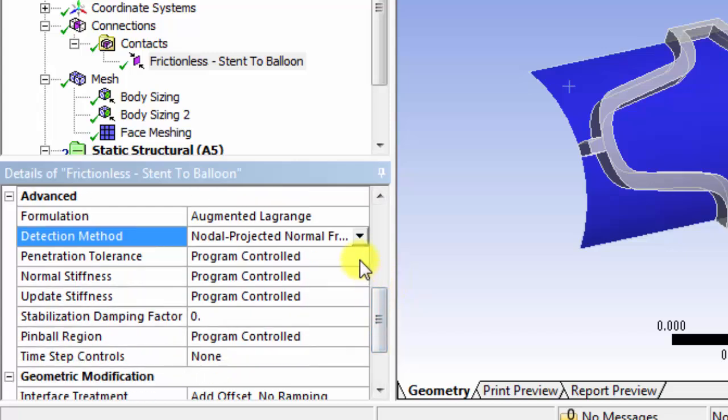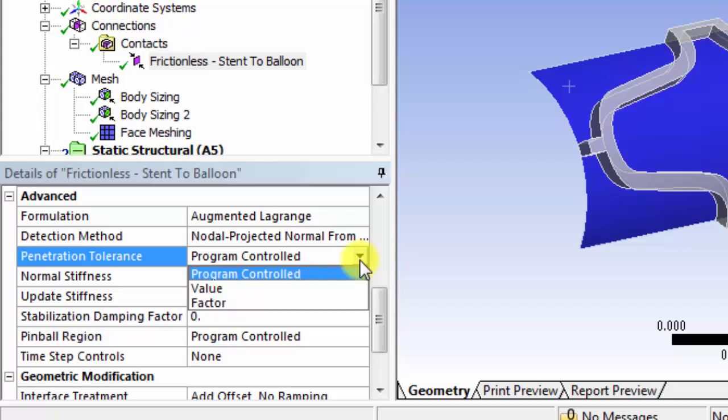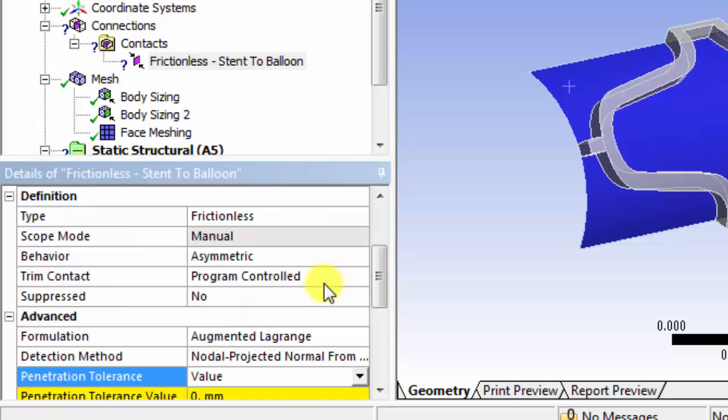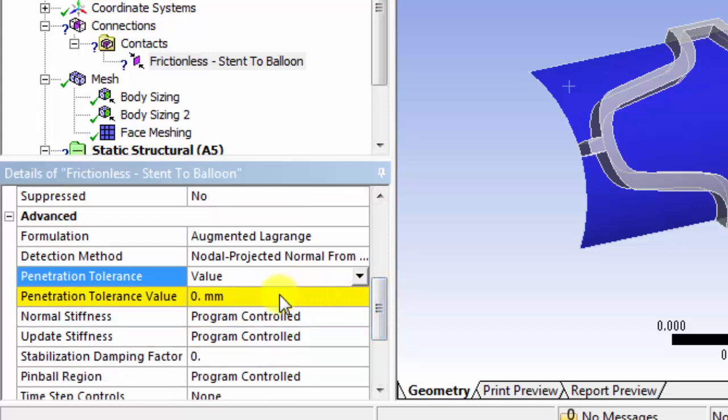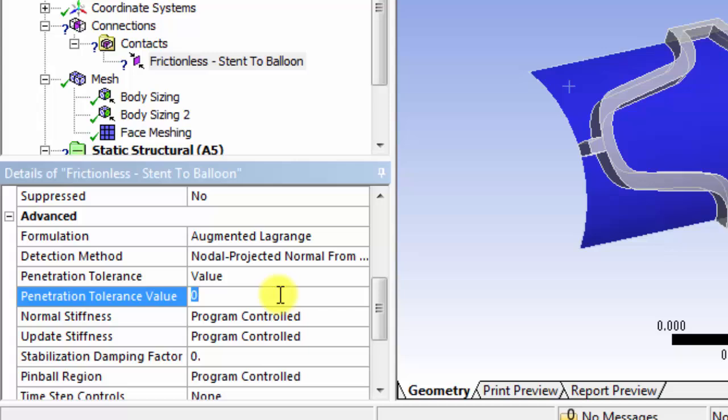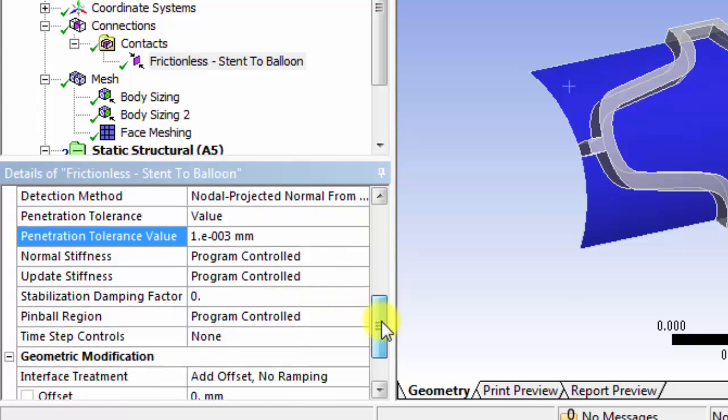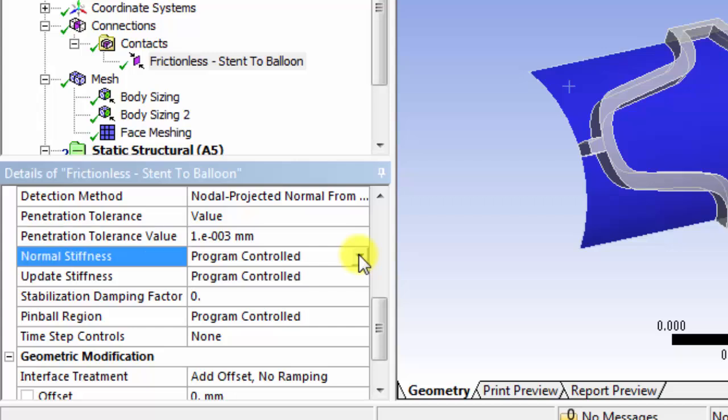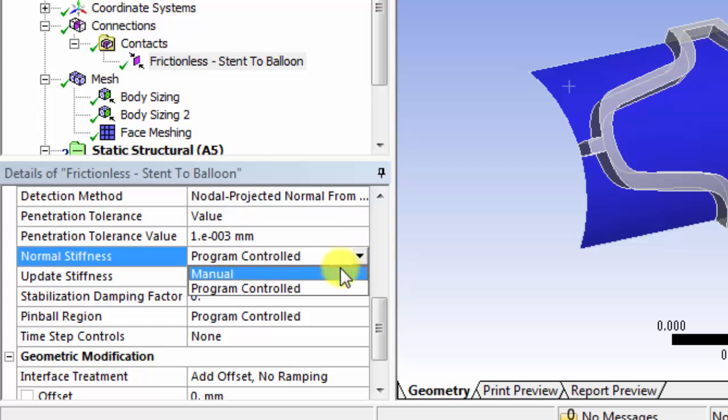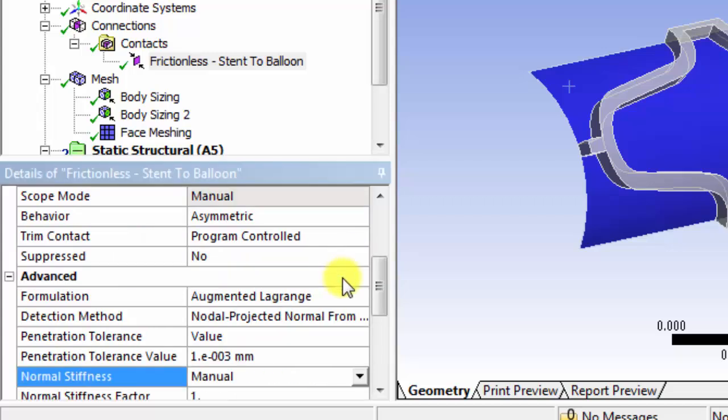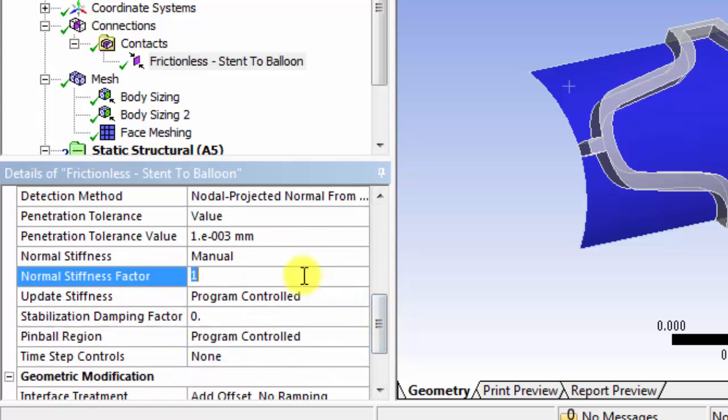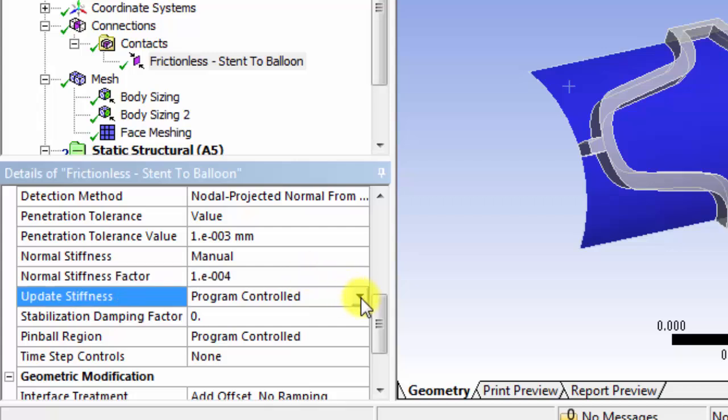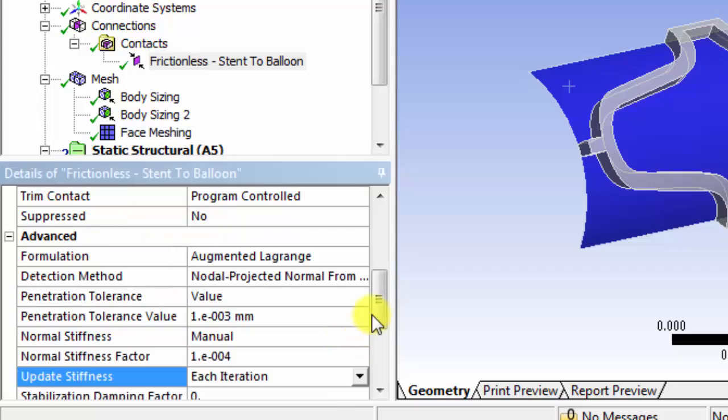And then we'll set a penetration tolerance ourselves. That way there's no penetration, or a little penetration within the contact. And we can set this to .001. The normal stiffness, we'll select manual. We'll set the factor to 1 times 10 to the negative 4th. Then we'll update stiffness each iteration.